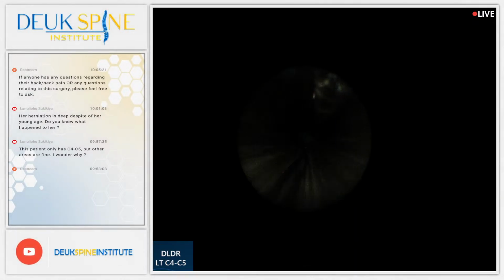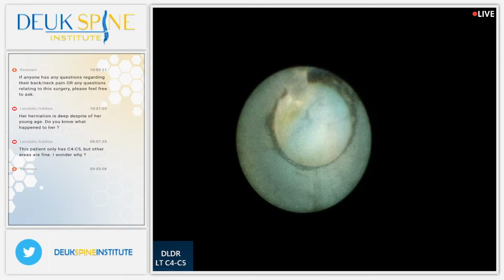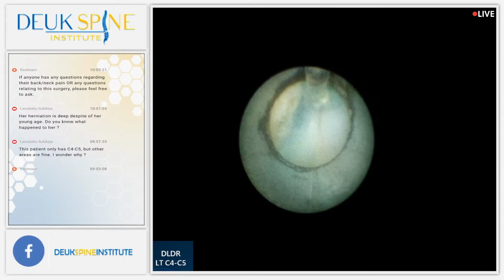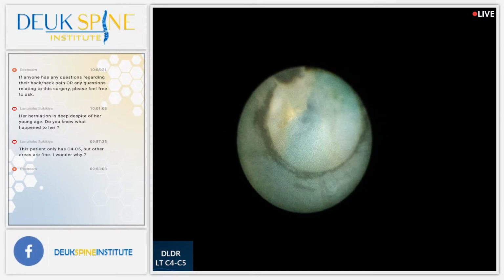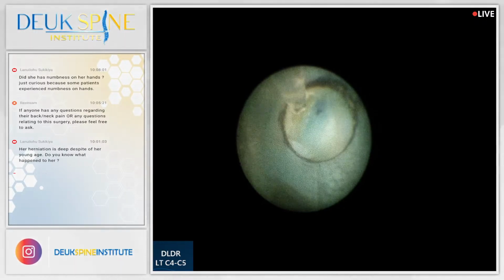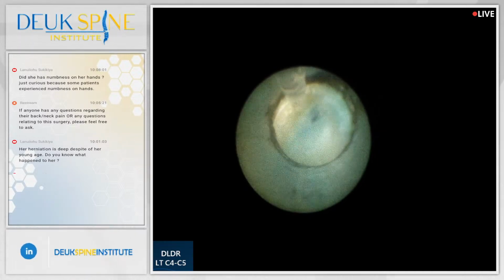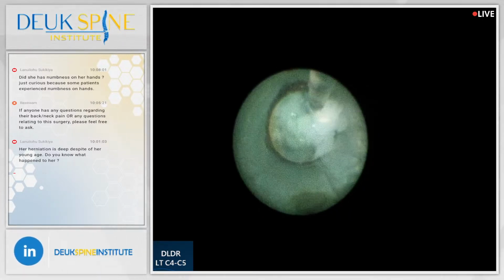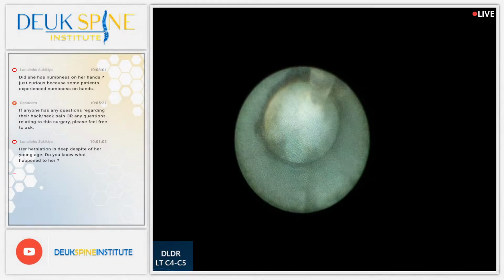The effect of the laser, when it blasts the tissue, you guys can see that there's actually, you can imagine that that's about 1/20th of a millimeter effect. So the laser is the most precise tool in medicine. With a precision used endoscopically, like I am, a precision of 1/20th of a millimeter. Now there's nothing in medicine. Oh, there's another herniation, a big one. Right there. You guys see it? Yes, we do.